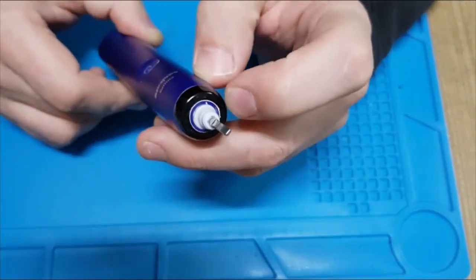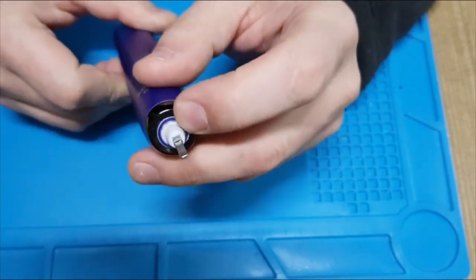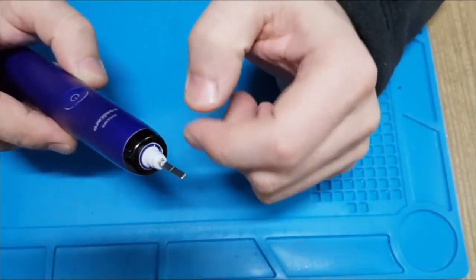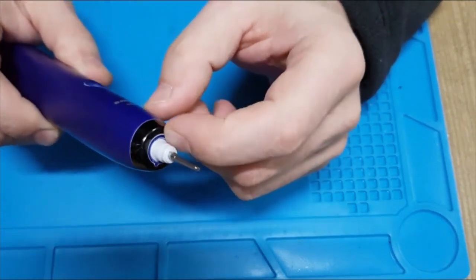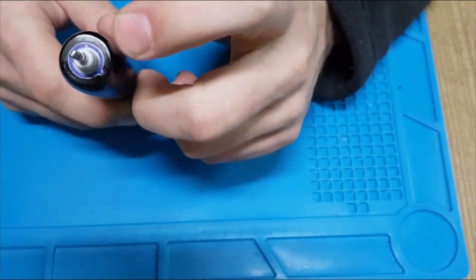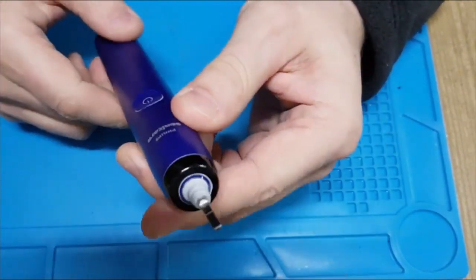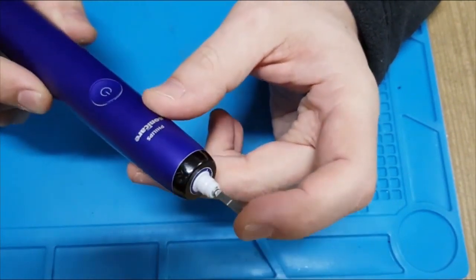Usually the biggest part that you need to look out for is this rubber part. You always have to remove the brush part and wash it, so as not to let some gunk build up and damage the rubber part. Because if you damage this part, you usually destroy your toothbrush. But it has another weak point, which is usually a mechanical one.